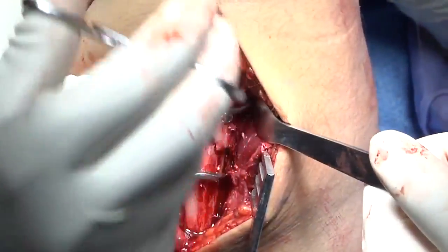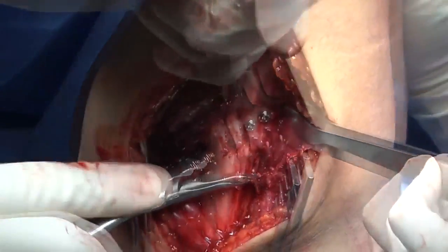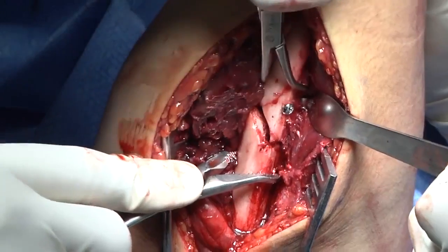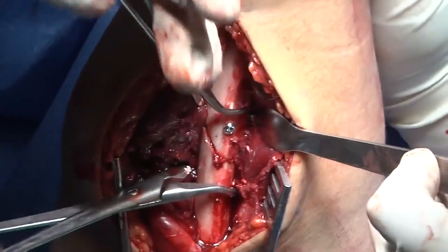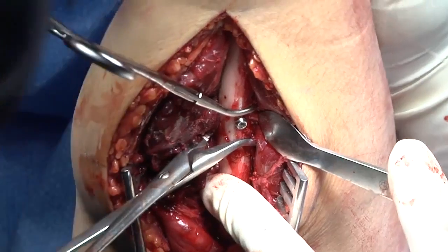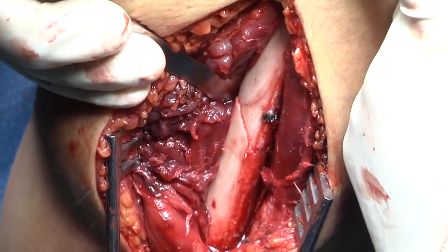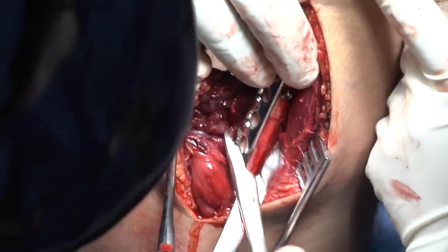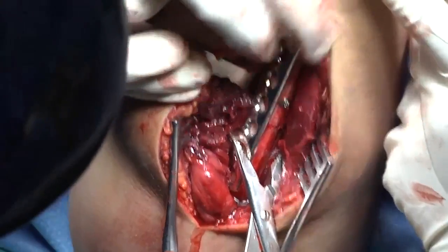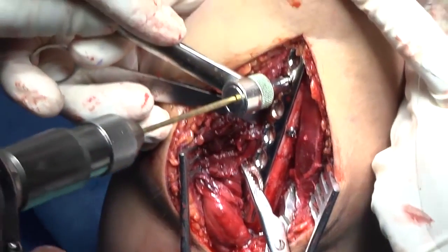Once this is complete, reduction of the main fracture line is achieved with the aid of two small fragment reduction clamps and distraction at the fracture site, followed by placement of a clamp across the fracture. In this instance, further lag screw fixation across the main fracture line was omitted to avoid the risk of splitting the small butterfly fragment.